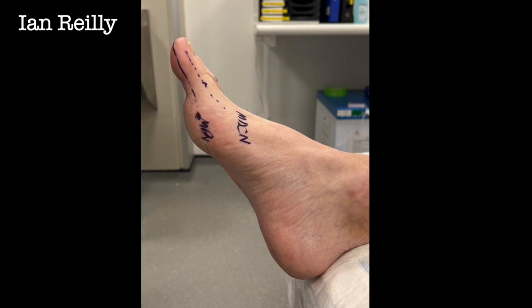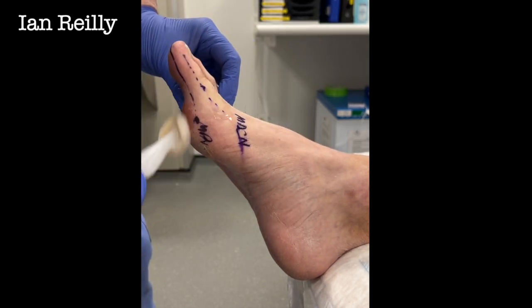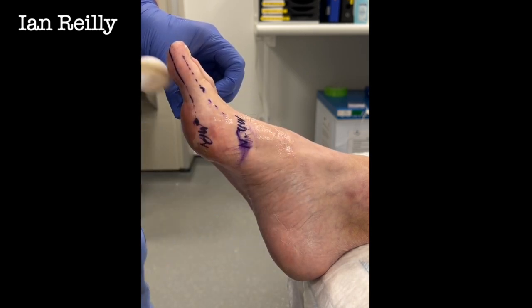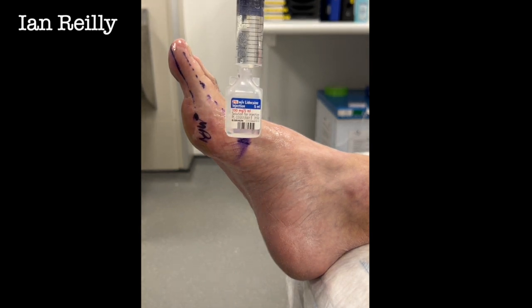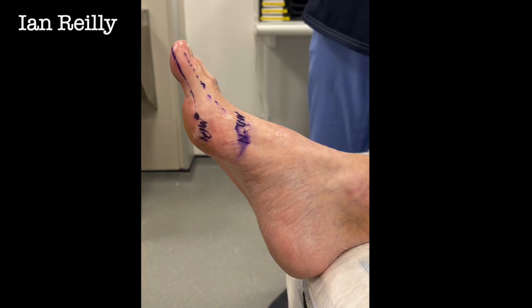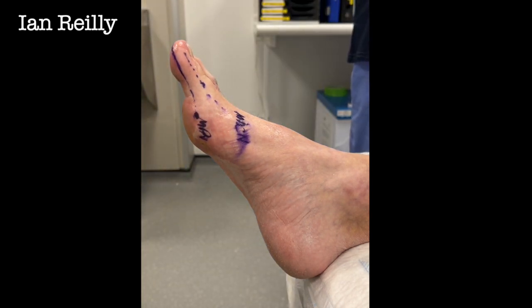When patients let you know they're not completely numb, you have to put a bit more local anaesthetic in — it's nearly always the plantar nerve you need to top up. We're going to do a bit of skin prep using chloroprep, which will make my purple marking disappear, but we'll clean properly. For today we're going to use 2% lignocaine — lidocaine is the INN — a 23-gauge needle, and a luer slip syringe, not my favourite but it'll do for today. We'll take the air bubbles out.